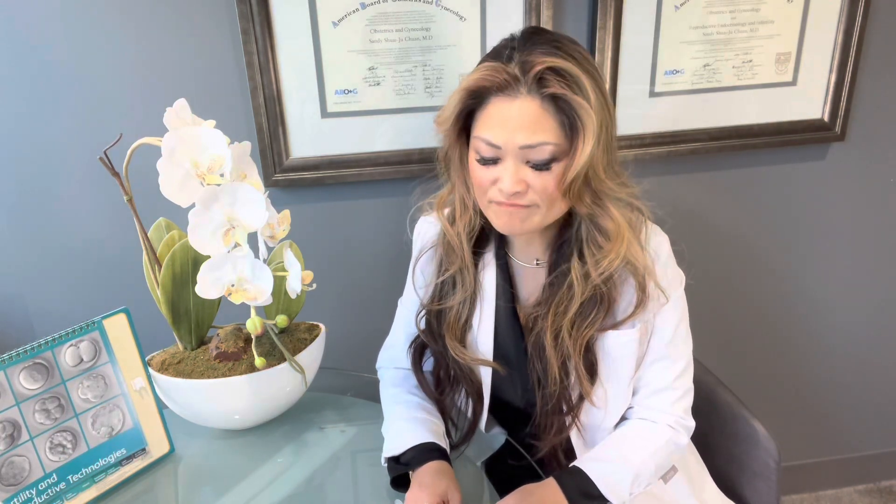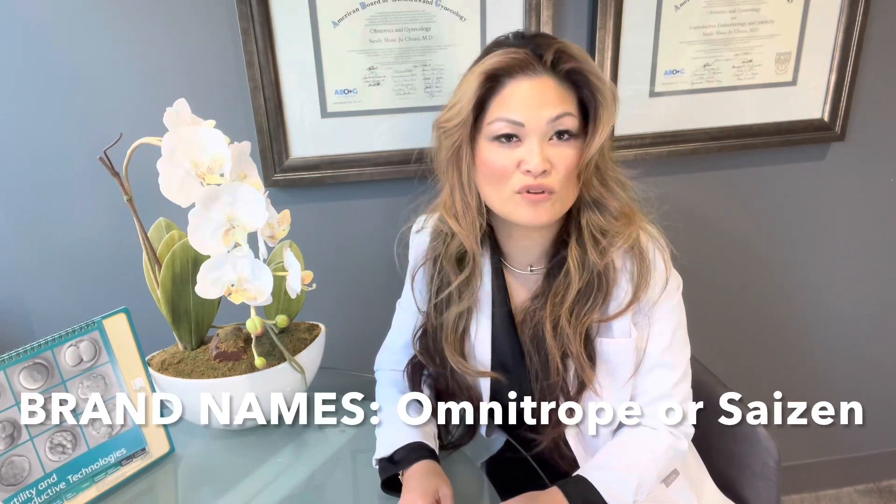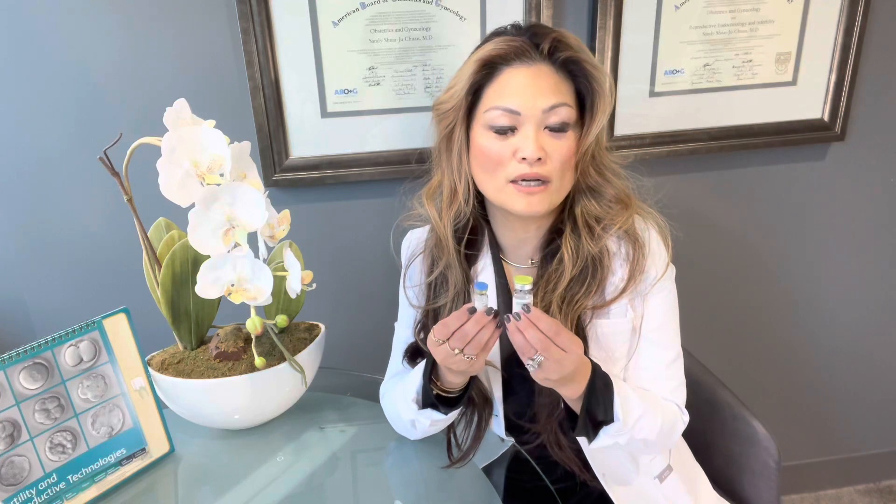Growth hormone comes in many different brands. Depending on the pharmacy and sometimes on cost, you may be dispensed either Sizin or Omnitrope, which are two very common brands, but you may simply hear us refer to it as growth hormone, which is the general name for it. When the growth hormone comes, you're going to usually get it in two vials. One is going to be a vial of just fluid and the other is the powder, which actually contains the medication.